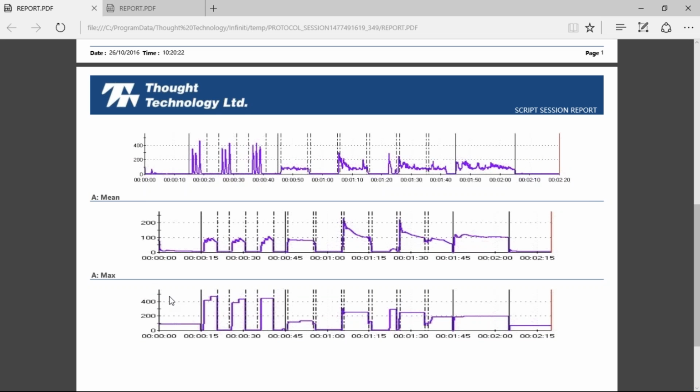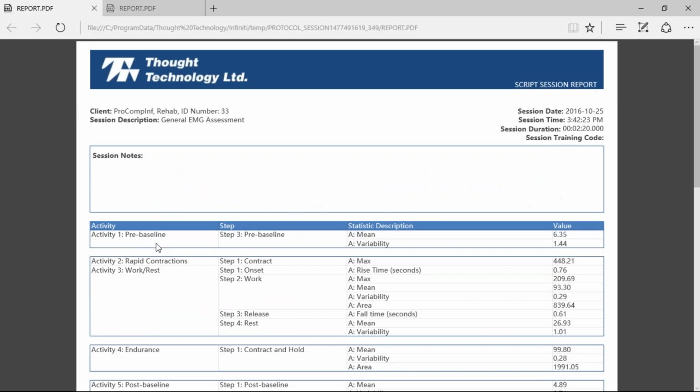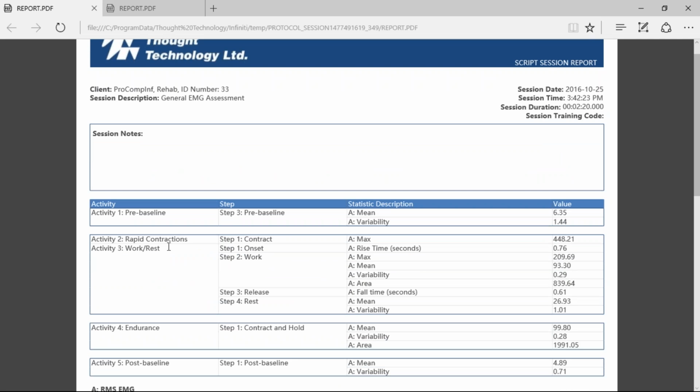So one thing we've been working on a lot in recent months has been to increase the offerings we have for the reporting side, because there is value to it. We're trying to identify what that value is, what we're really trying to do with each training session or training category, and generating reports that line up with that.